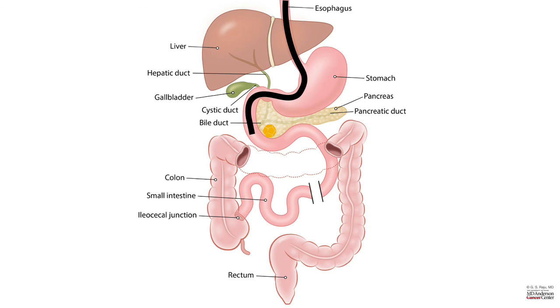So, we talked about different types of scopes and what they do, how far down the gut they can go, and I hope you learned a lot in this lecture.